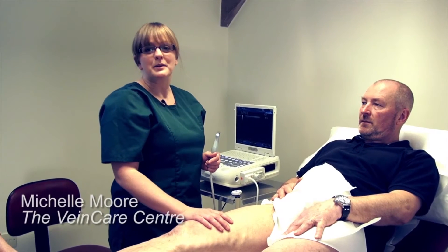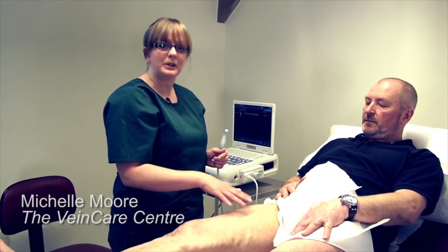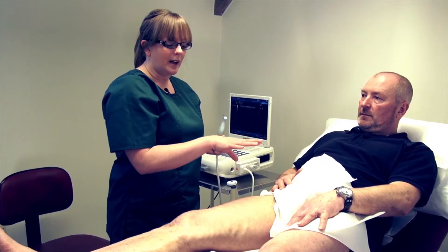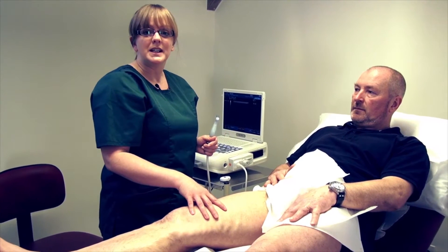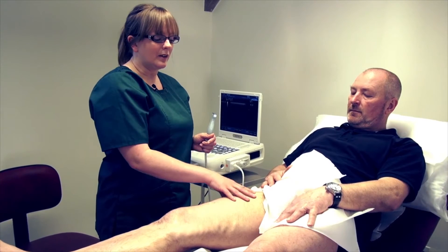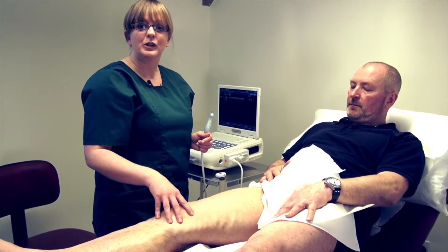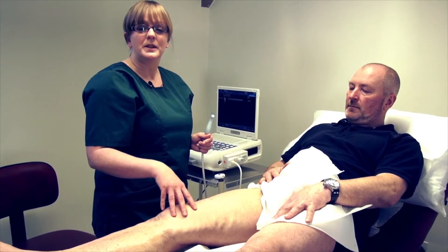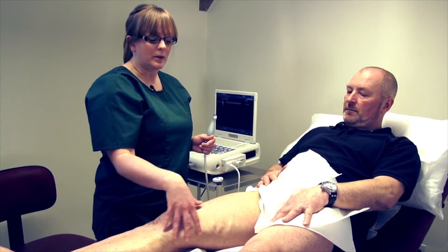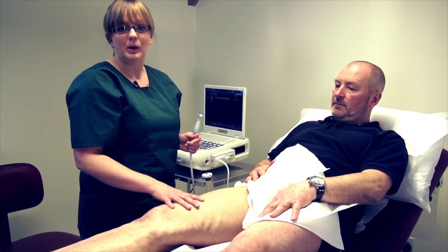Initially, before any treatment can commence on superficial varicose veins, we need to ensure that the deep vein is normal. Any history of previous DVTs is significant and must be assessed. We start from the groin crease and work down to just below the knee to ensure there is no deep venous problem. If there was a deep venous problem, it would make matters a whole lot worse.